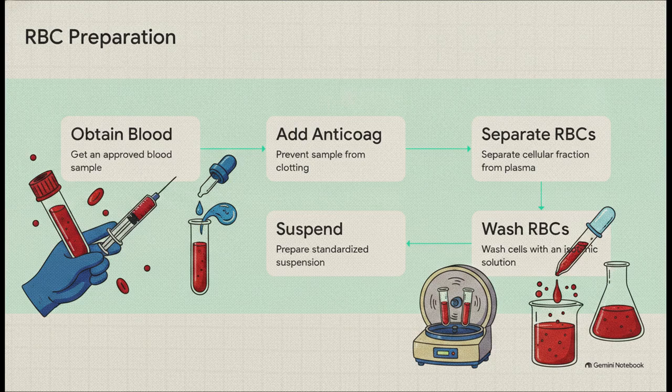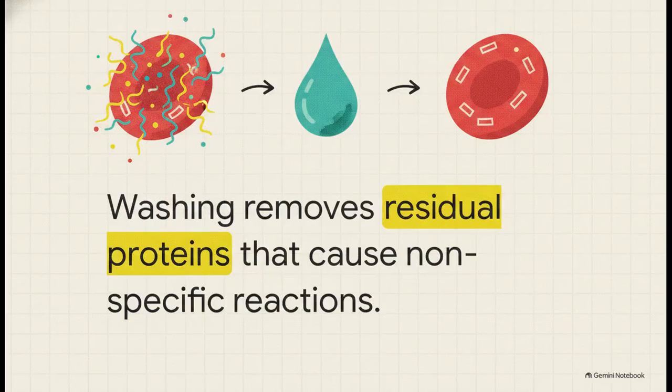But the real magic happens next, washing the cells with an isotonic solution before finally preparing the standardized suspension based on whatever that specific test requires. So, the crucial point is why that washing step matters so much.